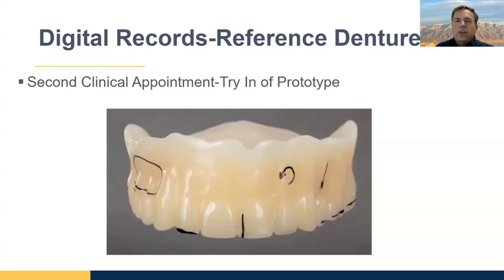You can determine how thick you want your resin over the housing, in other words, how much cutback there is between the bottom of the teeth and the model. It's usually 0.5 millimeter.